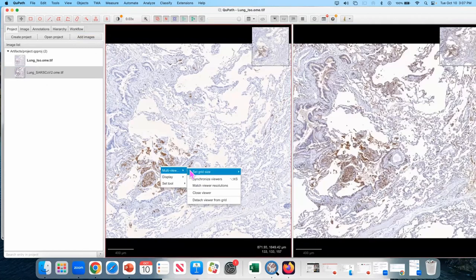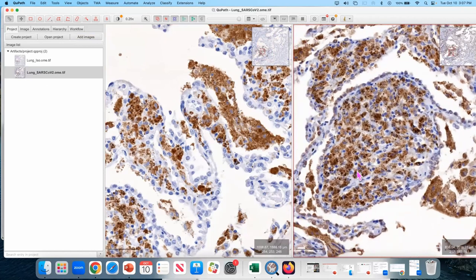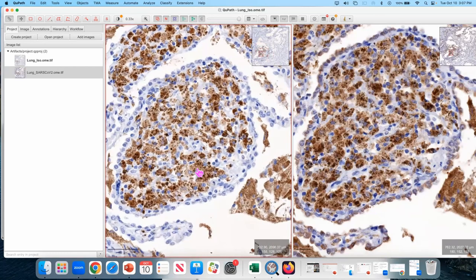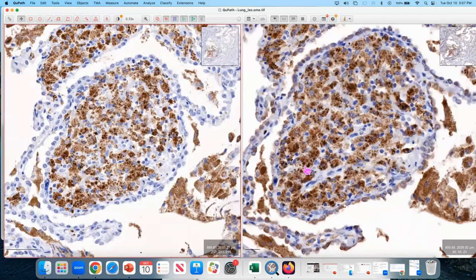And by default, they start. Move to this area. So now hopefully it's quite clear what is the true staining, which is right here, and what is the non-specific stain.